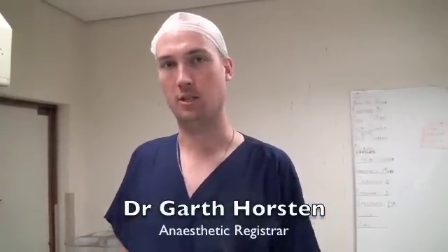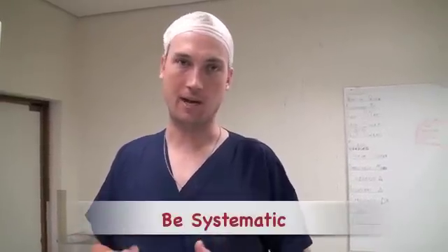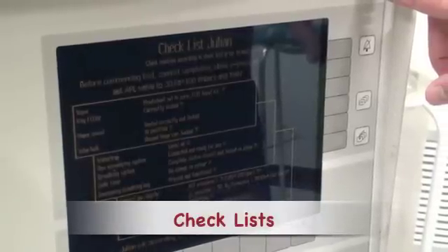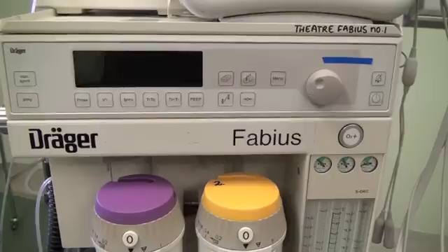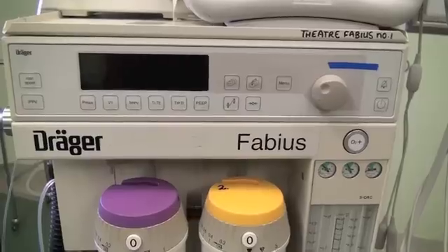When you're learning how to check an anaesthetic machine, the first thing to remember is that every machine is different and you need to have a systematic approach to checking any machine. Some machines have checklists that come up on them; some you just read and do on your own, while others require actions and confirmation. Today we are going to run through the machine check of the Draeger Fabius. The aim of this video is to demonstrate the fundamental principles of checking any anaesthetic machine.